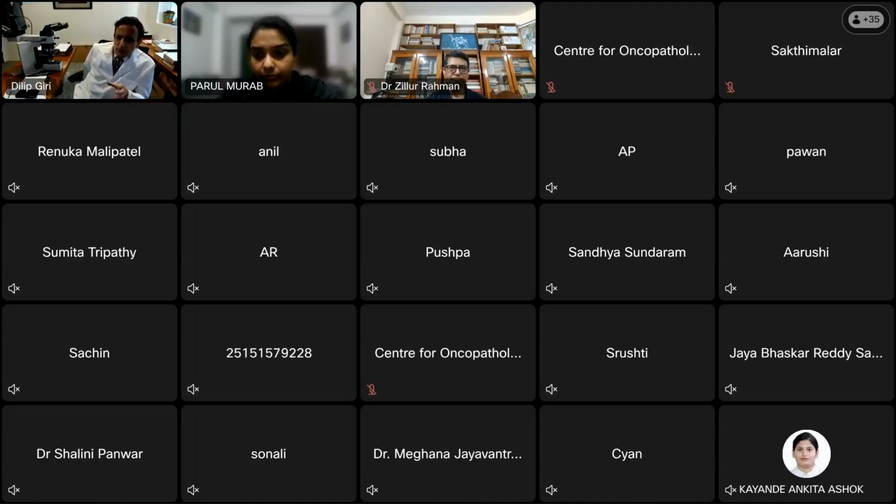Now, if this is something that bothers you, then I think you should show it to others. That is, I think, one way of avoiding a mistake. Depending on your experience, you will probably be able to make a better judgment. So there is no one rule of what exactly is the difference between UDH and ADH. You have to have a constellation of things in your mind.